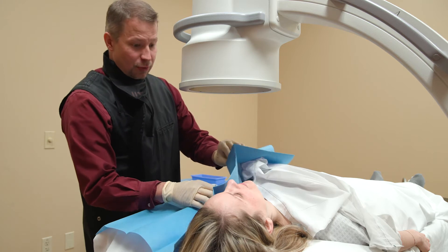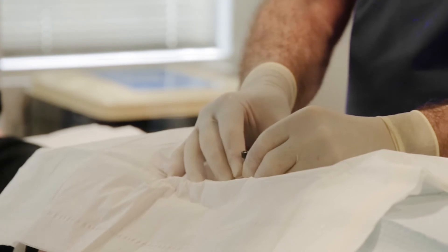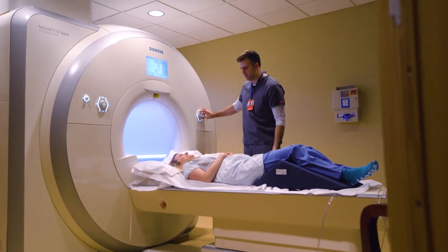All right, we're all done — that went perfect. Fluoroscopy can also be used to help relieve back pain. Your job is to hold still and not move anything, okay?